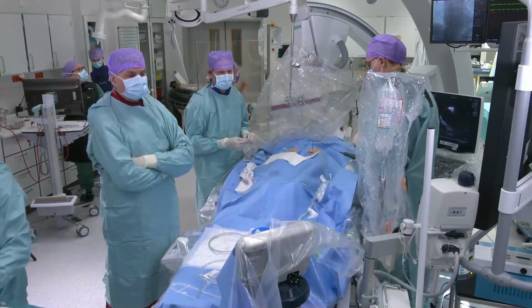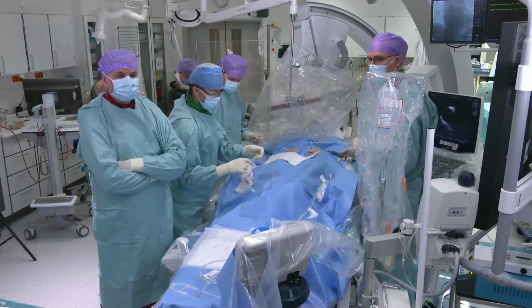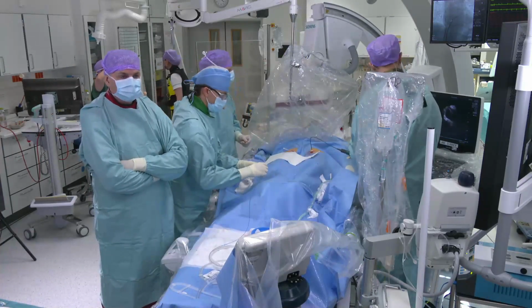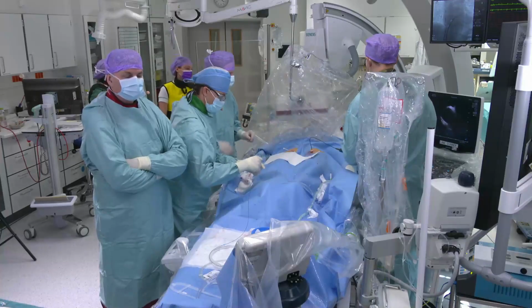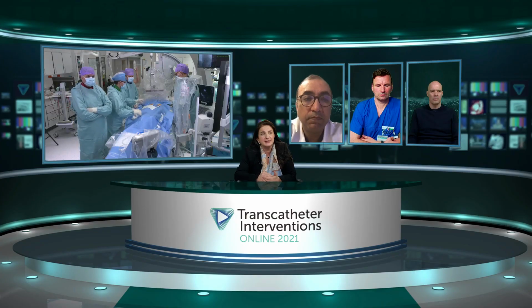Here in the United States, for the most part, we are using transesophageal echo, now more and more incorporating ICE. Of course, it would be a fantastic step forward with no need for general anesthesia.